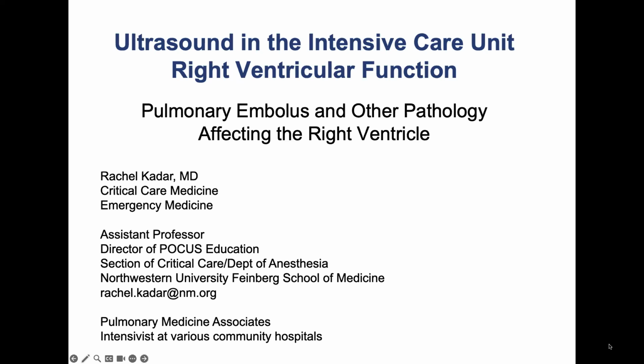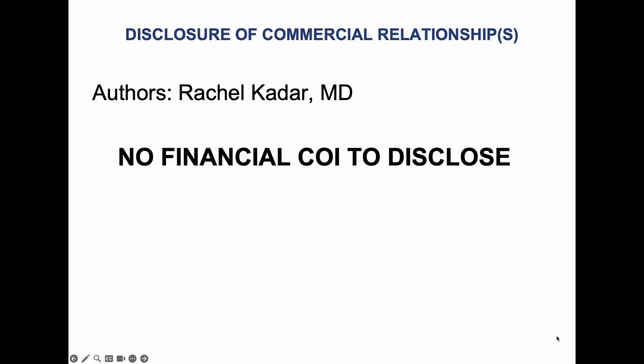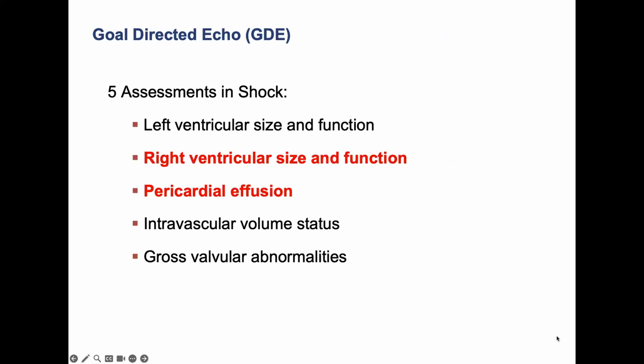Okay, so today we're going to talk about ultrasound in the intensive care unit, right ventricular function. We're going to talk about pulmonary embolus and other pathology affecting the right ventricle. I have no financial disclosures.